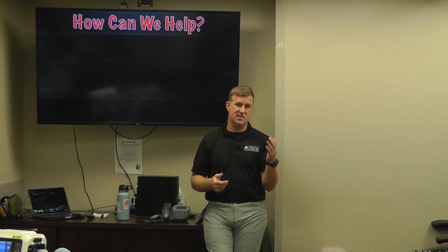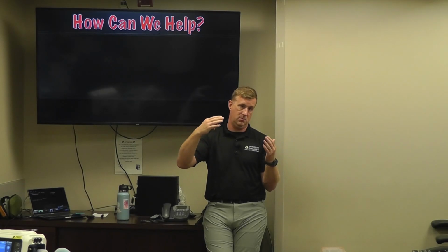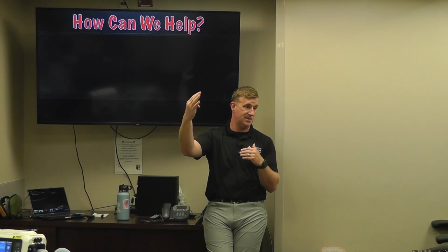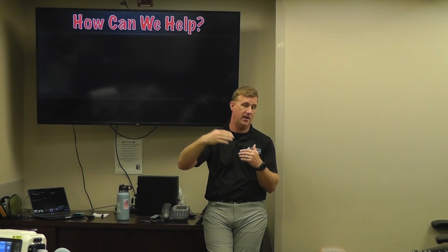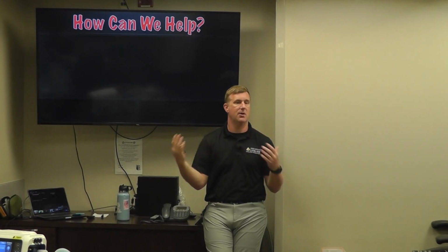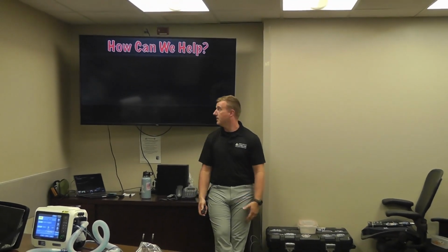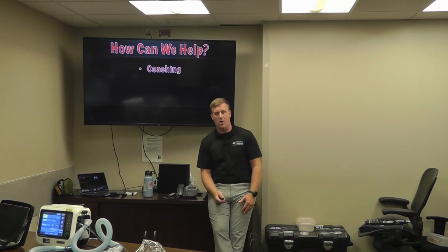What CPAP does is it helps you oxygenate. What we call CPAP plus pressure support, which is equal to BiPAP, helps you ventilate. It helps you take a bigger breath. It helps with tidal volume. Okay? Everybody tracking on this? Okay. So how can we help this work?